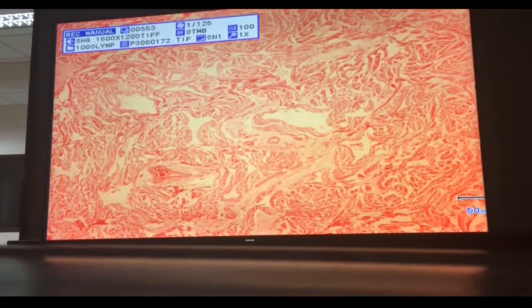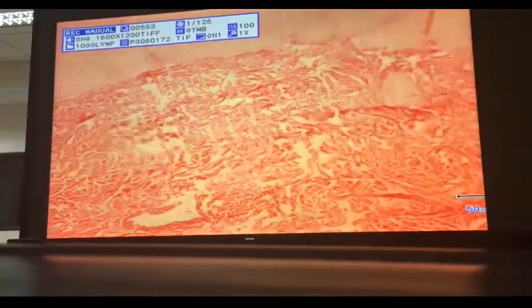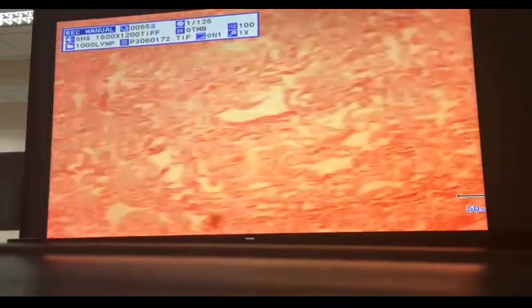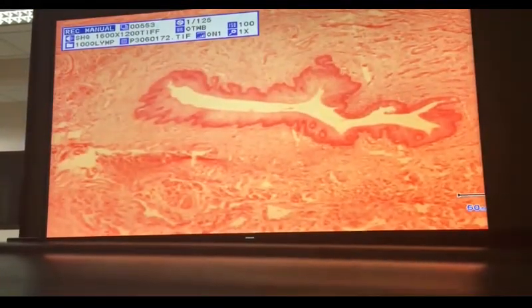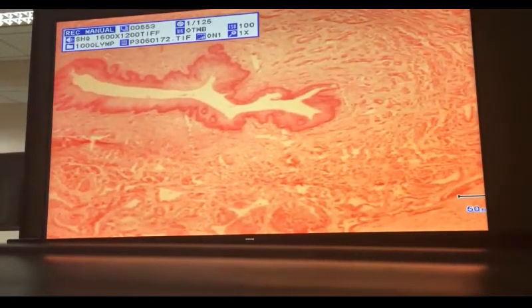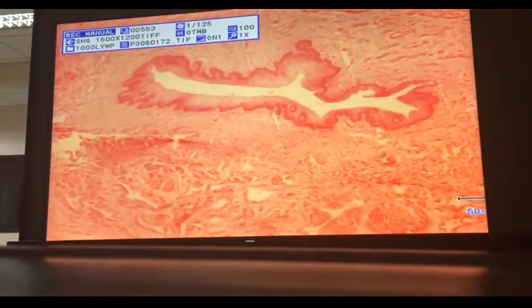How many cavernous bodies are there? Three. Two dorsally located, which are called corpora cavernosa, and the corpus spongiosum. The corpus spongiosum is very easy to identify. That portion shown is the corpus spongiosum.